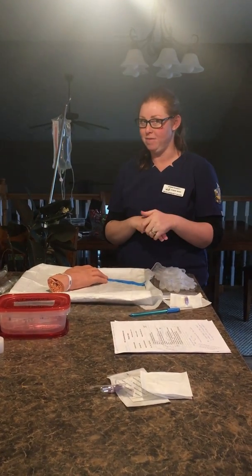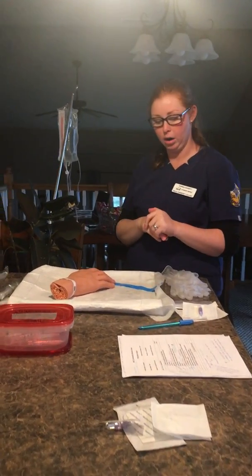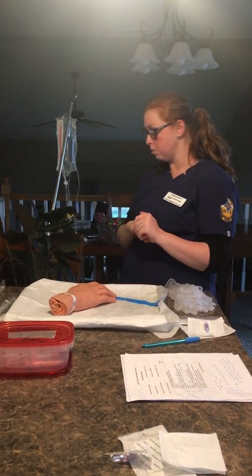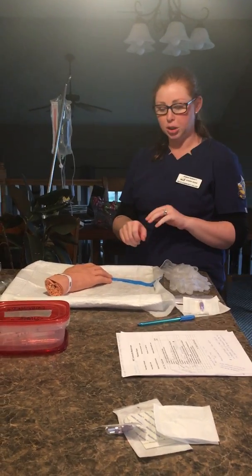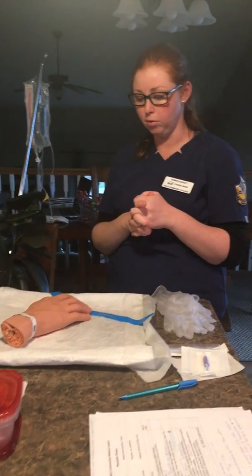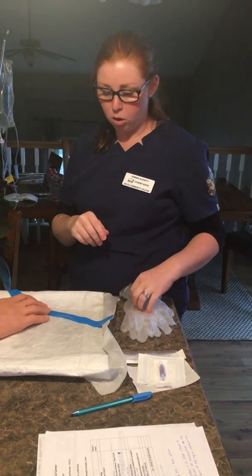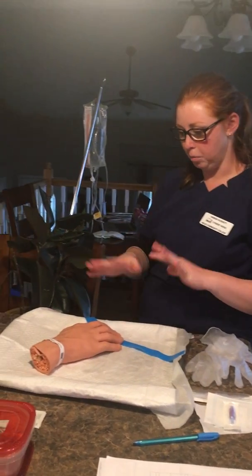We're back here with Ivy. We're going to go ahead and get our IV catheter inserted so that we can get her hooked up to this IV. I'm going to verify my patient, have her state her name and date of birth, and cross-reference that with her medical record.